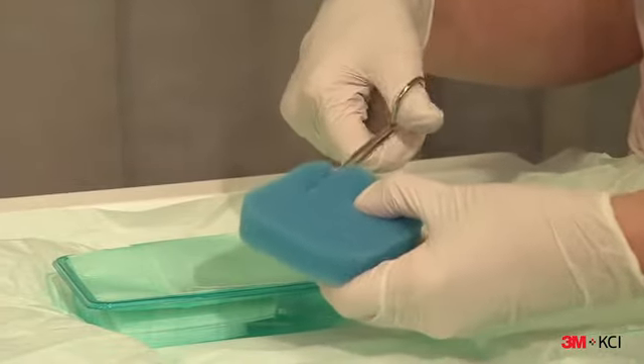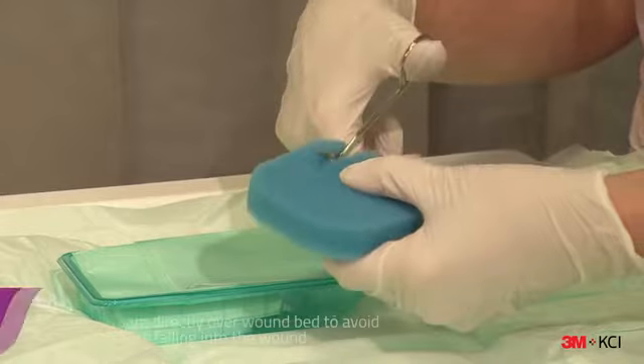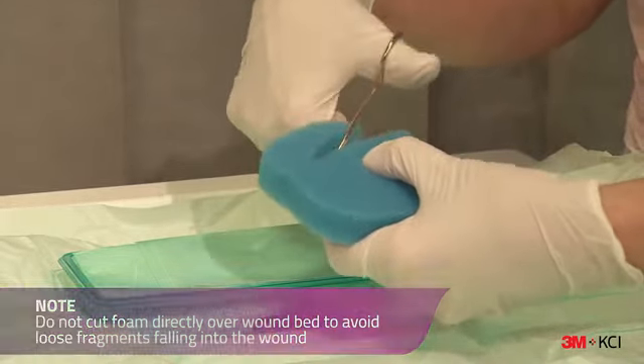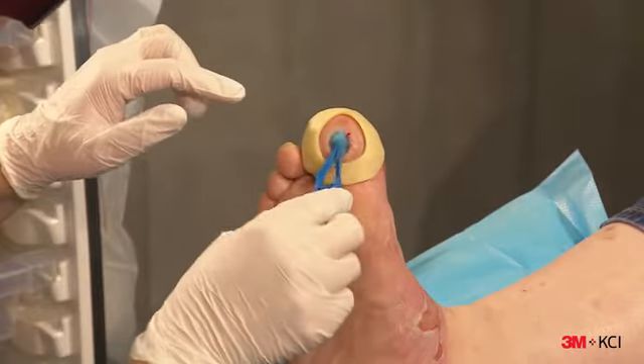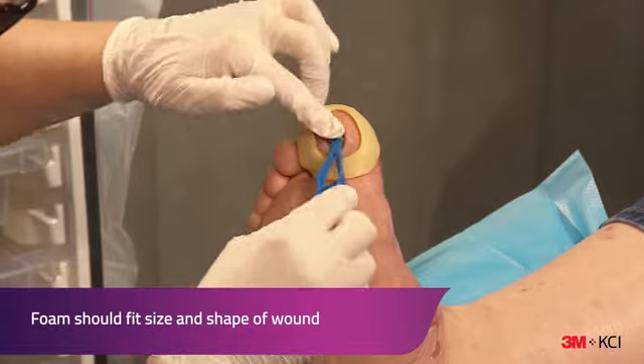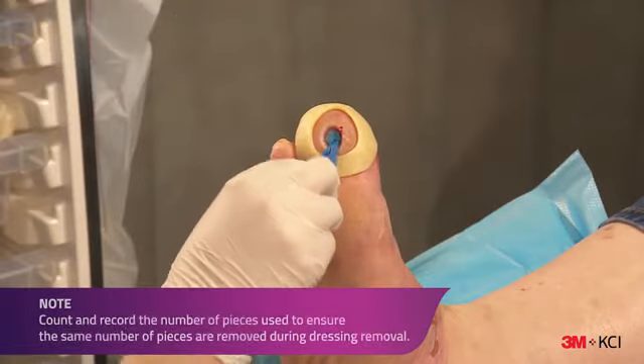Next, cut the foam to fit the size and shape of the wound. Place the foam into the wound cavity, making sure the foam fills the wound cavity and extends above the wound margins.